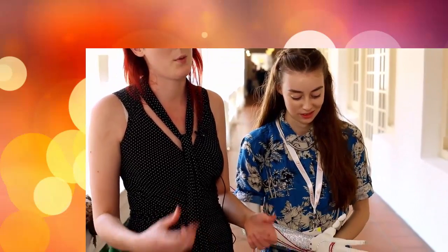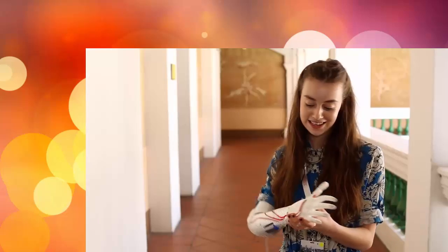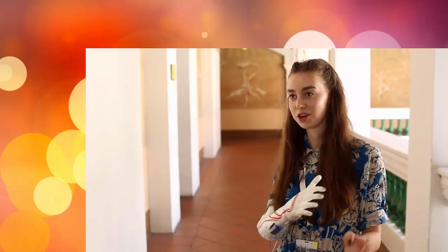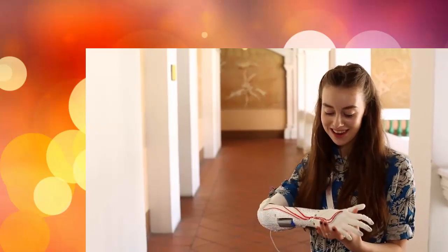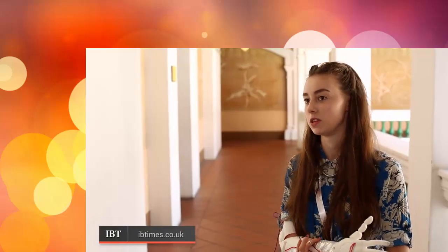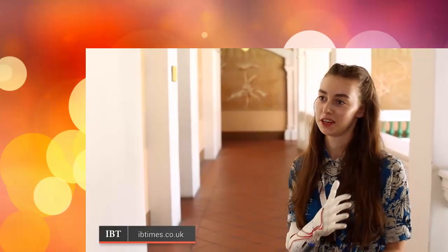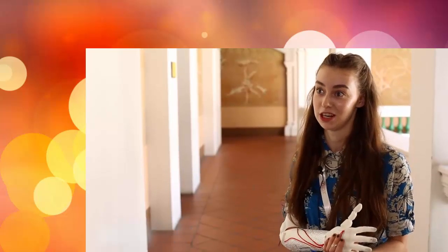Our very first bionic hand will enable amputees to pick objects up and do simple everyday tasks more easily. In years to come, I would like to have a different arm for every outfit, like shoes — that would be fab. It can always be lighter and it can always be improved, but so can everything else. So it's really exciting.